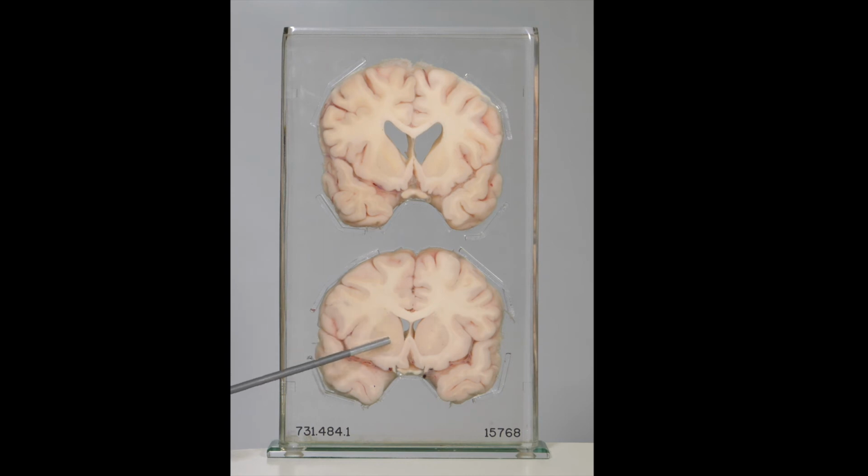can be seen here. It is also worth noting that in the Huntington's disease sample, there's cortical atrophy across this region here, where we observe thinning of the gyri and the widening of the sulci, as well as the thinning of the corpus callosum. At the microscopic level, you will be able to see marked neuronal loss in the caudate and putamen, as well as astrocytic proliferation.